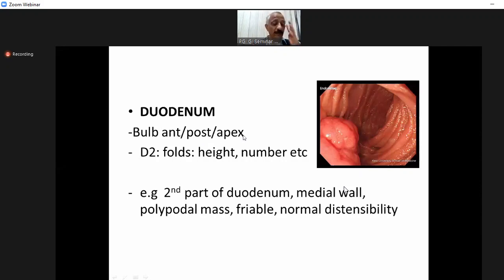For everyone, I would say that those who have access to a simulation model, it is easier to look at the anterior posterior wall. Otherwise, for every endoscopist, it is important that each one of you will do this exercise of putting in a scope and looking at where, in the left lateral position, when the endoscopic light is towards the anterior wall, towards the abdominal wall in an endoscopy suite with lights off.